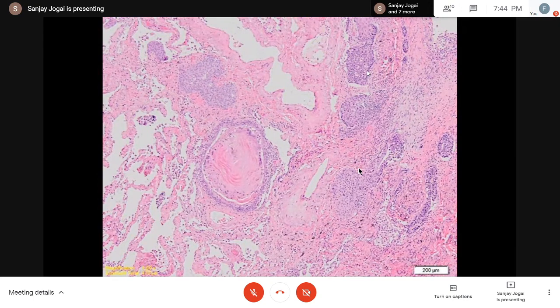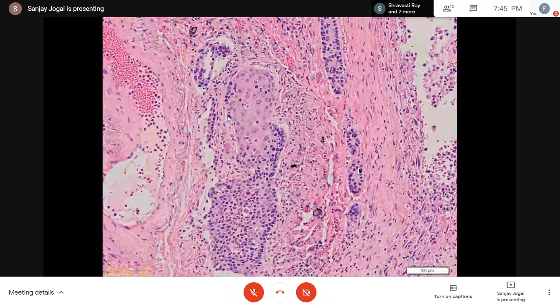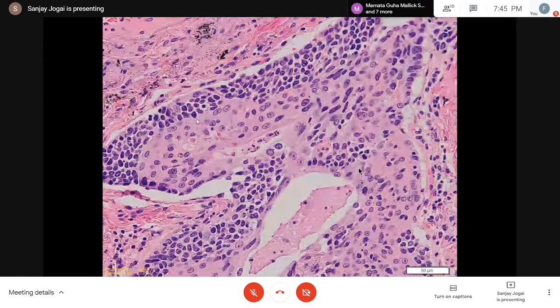of tumor there. Now, this is a very interesting field where you clearly see squamous cells, but together with that, you have got these peripheral palisading by those hyperchromatic cells. And this is another beautiful focus to show those cells which have a more stippled and hyperchromatic nuclei with the squamoid component. Now, what's going on here? So we clearly have two distinct tumor pathologies or tumor morphologies within the same tumor, so much so that in some areas it's almost closely admixed with each other.